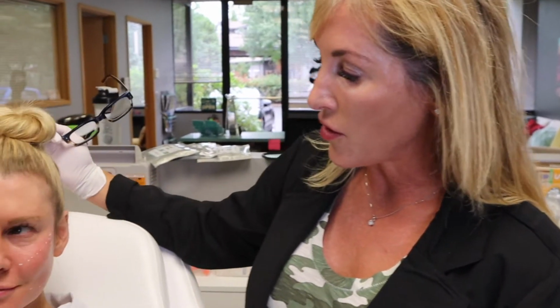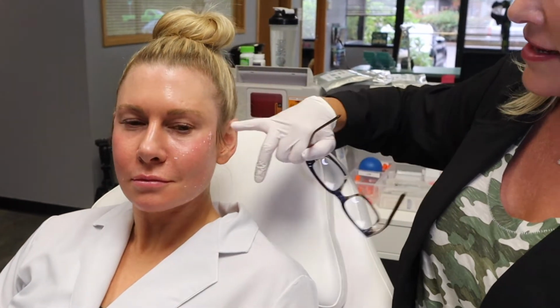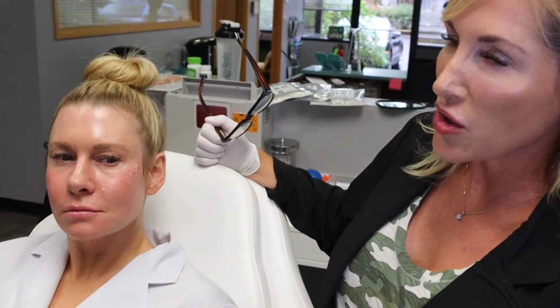Kim is in her early 40s and she's just starting to see some signs of tissue laxity. So we're going to pull up the tissue that she has that is starting to sag. This will be Kim's third or fourth treatment.